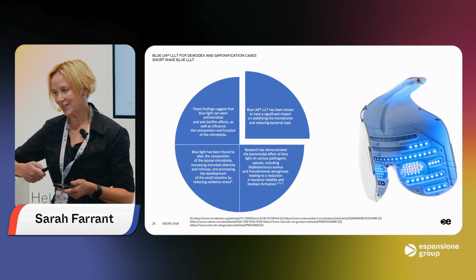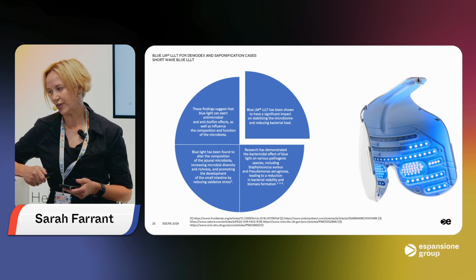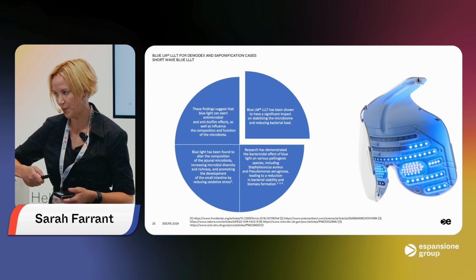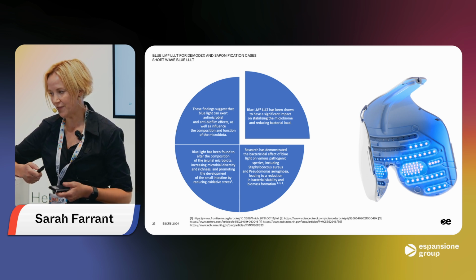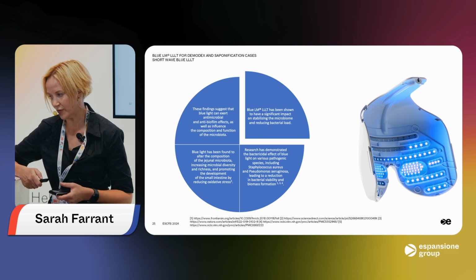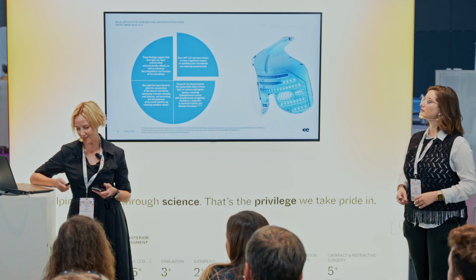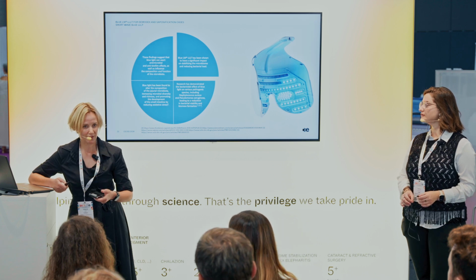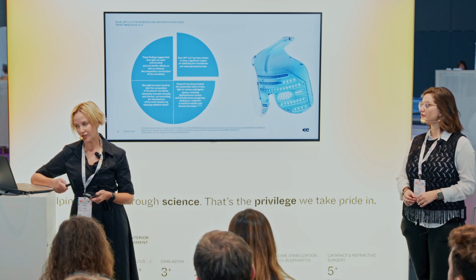So we have had some limited research so far, which helps us to understand that there is an impact on stabilizing that microbiome, reducing that bacterial load. We know the bactericidal effect of light on different pathogens like Staphylococcus, and it leads to a reduction in that homeostatic imbalance, as it were. So there's a lot of exciting research that we can develop in this field to really look at how we can utilize this for patients.